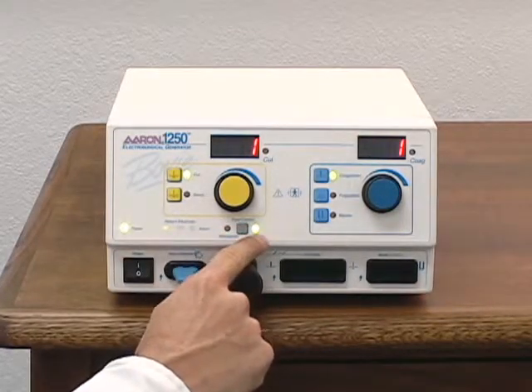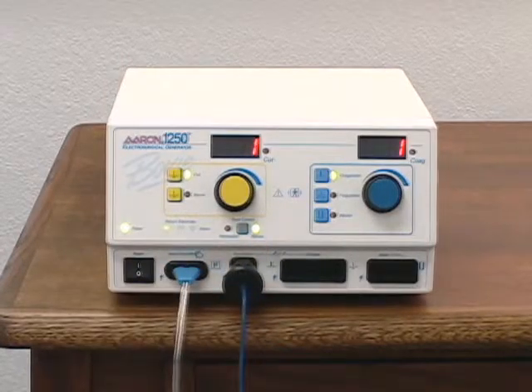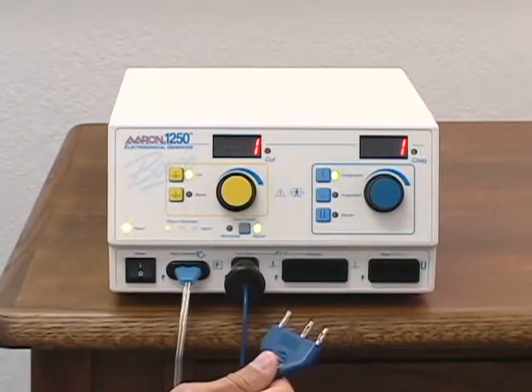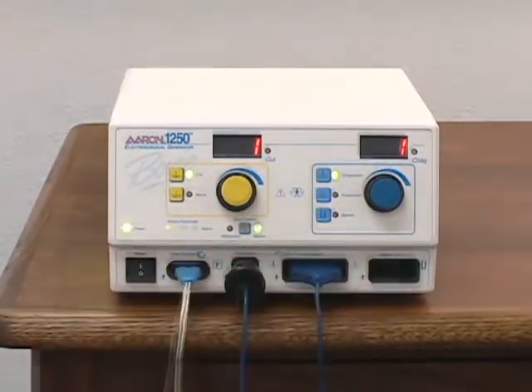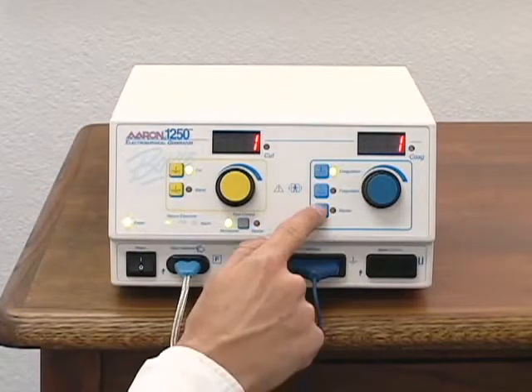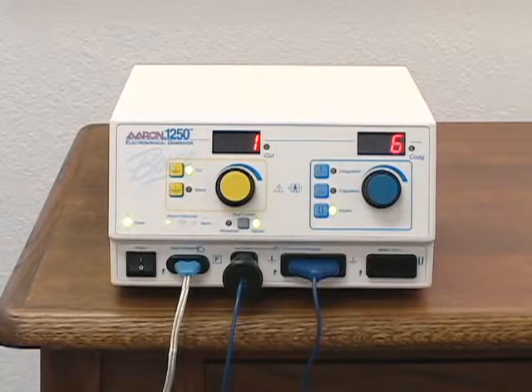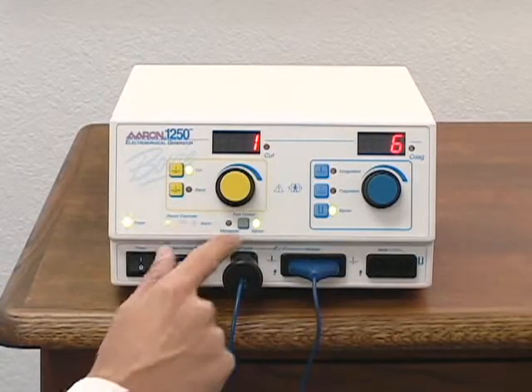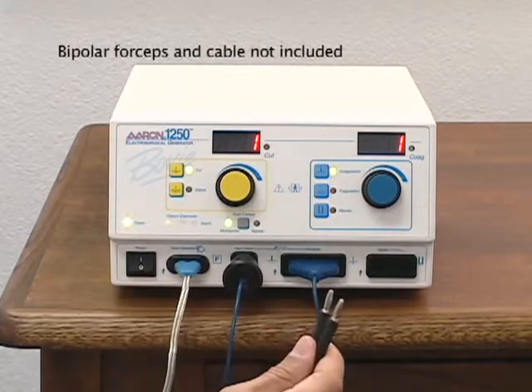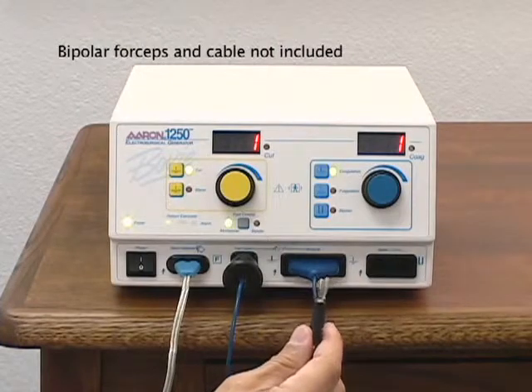Only the mode that is selected will be available for activation. To attach a monopolar pencil, insert the plug into the receptacle marked monopolar. To use optional bipolar forceps, select the bipolar mode. You will notice the foot control indicator switches to bipolar. This indicator must be switched back to monopolar in order to activate the monopolar foot control accessory. To attach the optional bipolar cable, insert connectors into the receptacle marked bipolar.